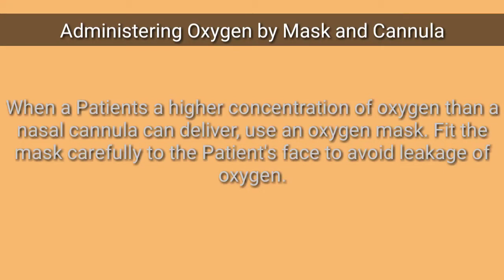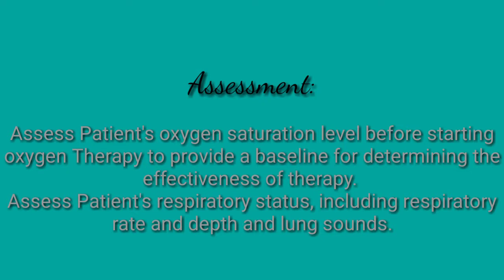Administering oxygen by mask. When a patient needs a higher concentration of oxygen than a nasal cannula can deliver, use an oxygen mask. Fit the mask carefully to the patient's face to avoid leakage of oxygen. Assessment. Assess the patient's oxygen saturation level before starting oxygen therapy to provide a baseline for determining the effectiveness of therapy.